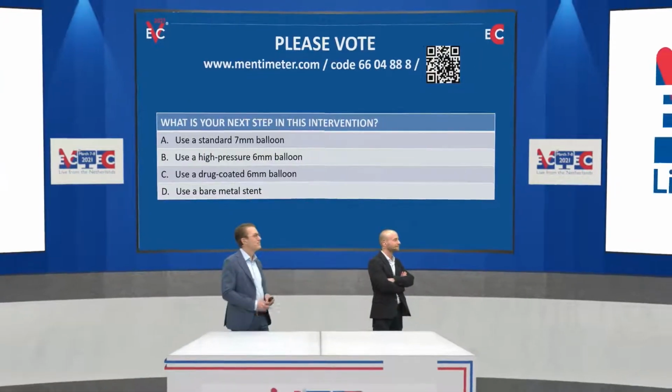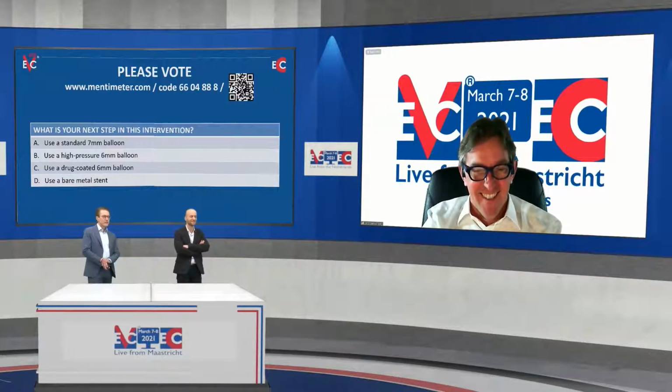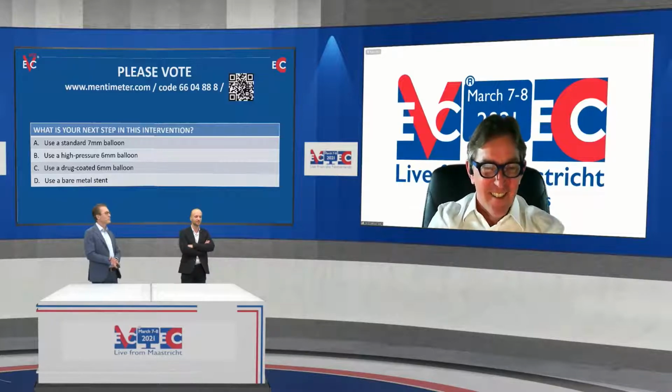I think that also indicates that it was not the size of the balloon of the initial dilation that caused the restenosis, but just the fact that patients with a dialysis fistula behave like this. Yes. And we had already a lot of people who would have used a drug-coated balloon in the previous intervention. So I think that it will be a very high percentage who would use a drug-coated balloon now.